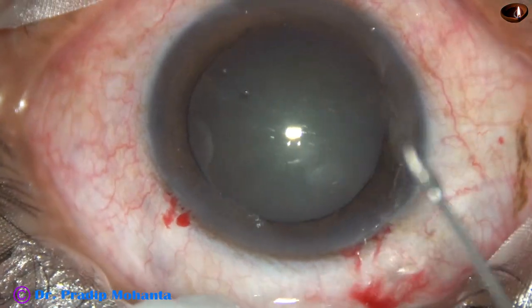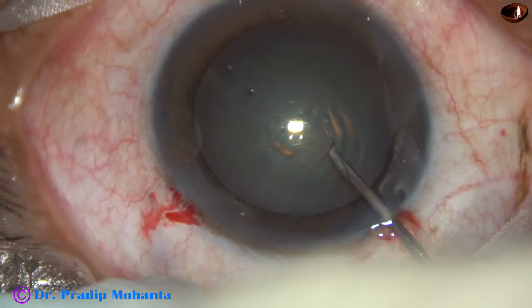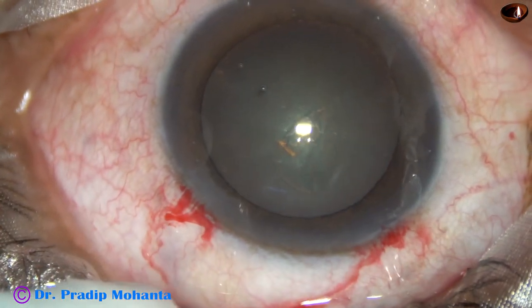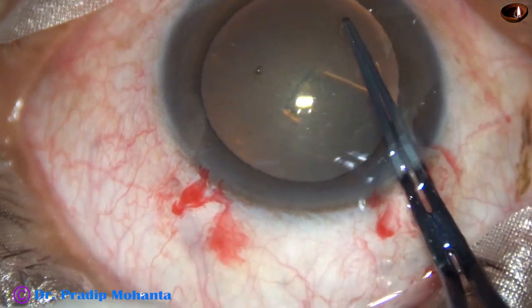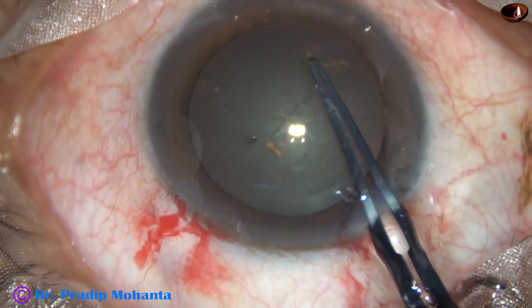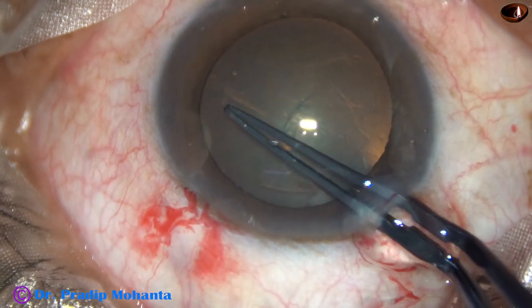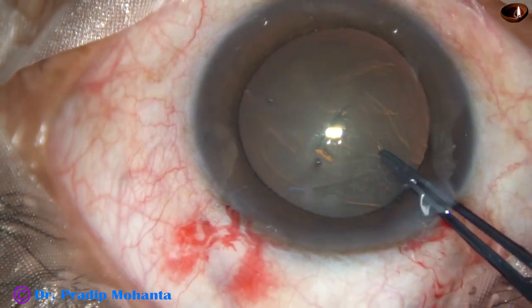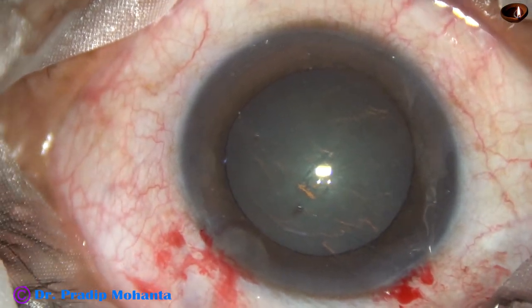Capsular axis. The anterior capsule is incised and the capsular tag is raised by a bent 26 gauge needle. Then I hold this capsular tag with Utrata forceps, go anticlockwise and do a continuous curvilinear capsulorhexis. This is a fairly round rhexis.